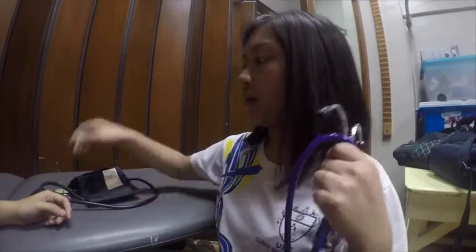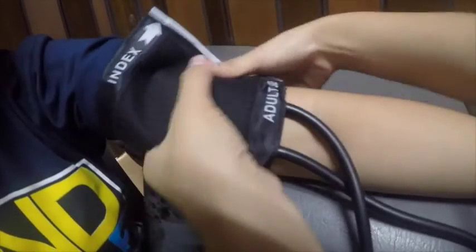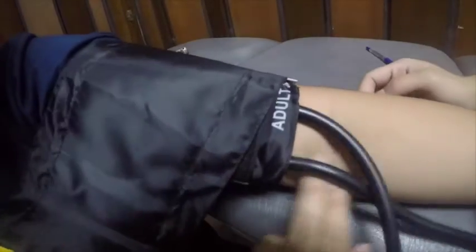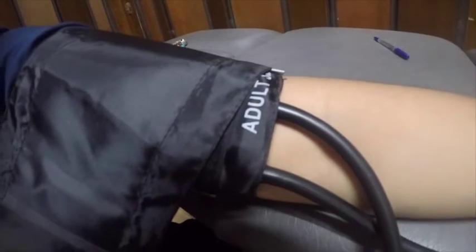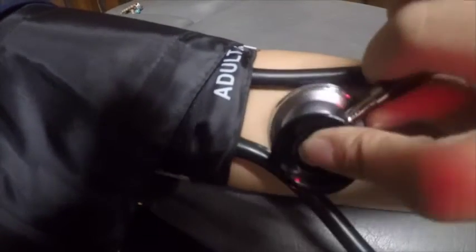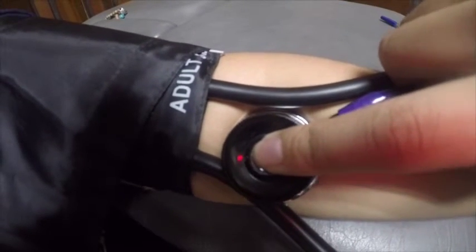So last, we'll be taking the blood pressure. So what we need is a stethoscope and a sphygmomanometer. The sphygmomanometer should be placed 2 finger breadths above the crease of the arm, right here, and it should be snugly fit. And then place the stethoscope over the brachial artery, and don't forget to ask the patient their baseline.